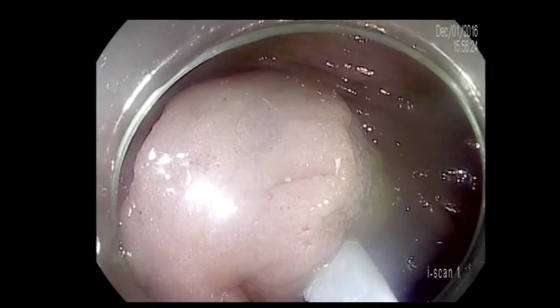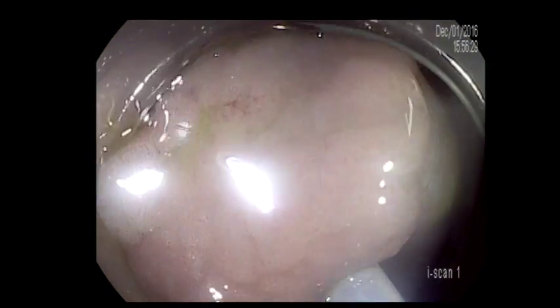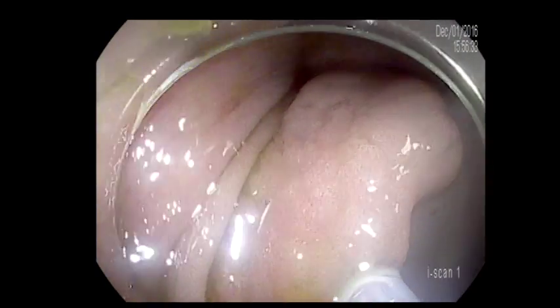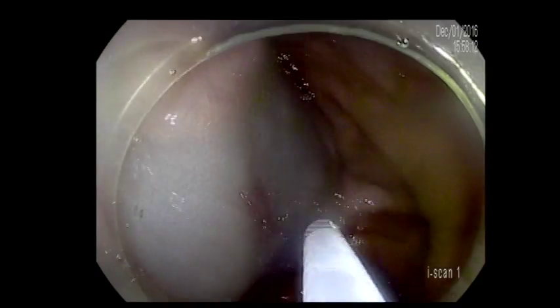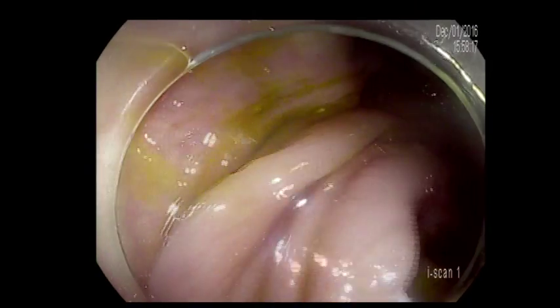Now we are injecting the upper part of the lesion, and it's injecting nicely. In retrospect, I would have just stopped here and removed that part. But I was a little bit greedy, and I kept injecting more and more. And as you can see here, we injected the whole lesion.